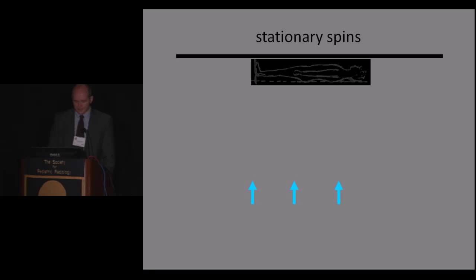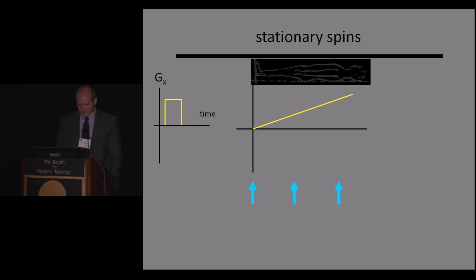So how does it work? Well, phase contrast imaging takes advantage of the phase shift of the spins, which occurs when they move along a magnetic field gradient. So in this diagram, we see the subject lying in the magnet in a uniform magnetic field, with the spins all in the same direction. If a gradient is applied by making the field stronger at the patient's head than at their feet, a phase shift occurs as the precessional frequency increases in proportion to the field strength. So here's the gradient being applied, and the phase shift being shown here by the clockwise rotation of the arrows.